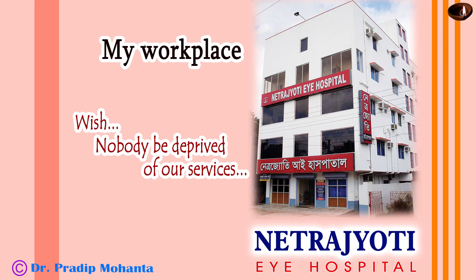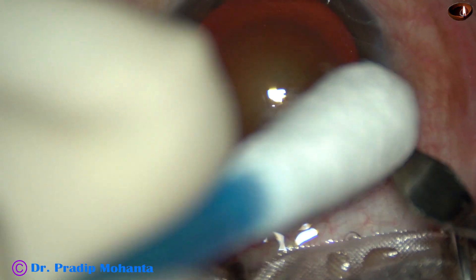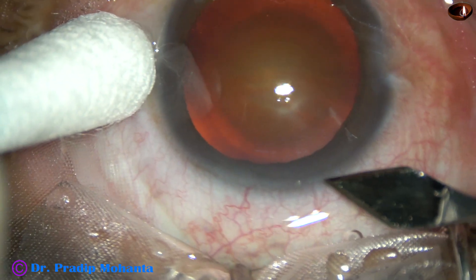Friends, welcome to my workplace at Ranaghat, West Bengal, India. This is a cataract with grade 3 plus nuclear sclerosis. Let us observe this surgery.